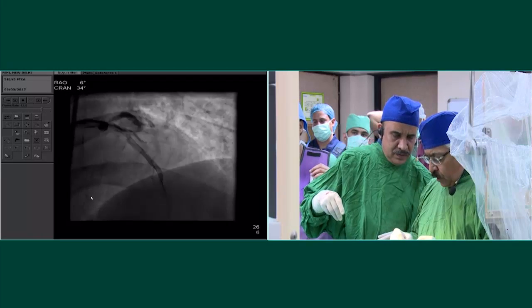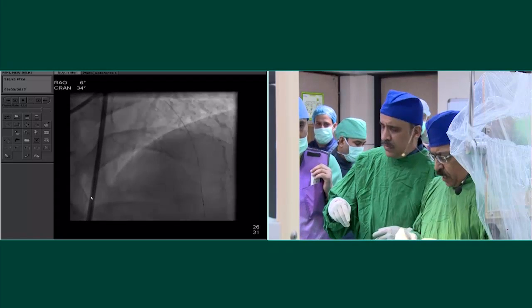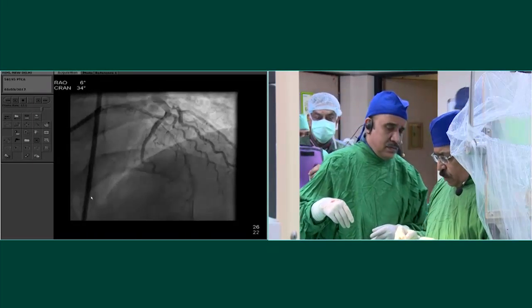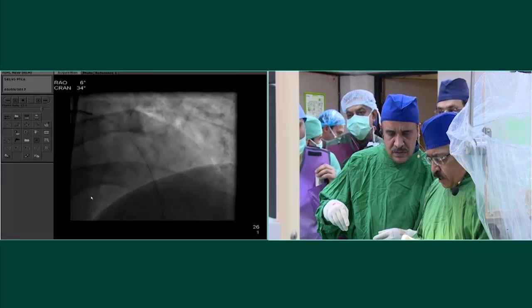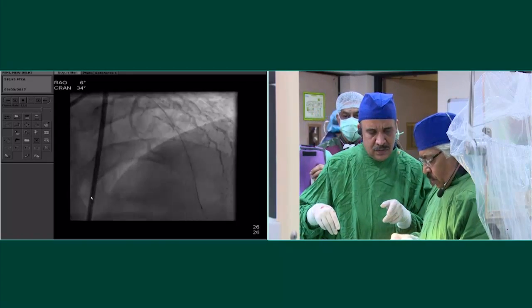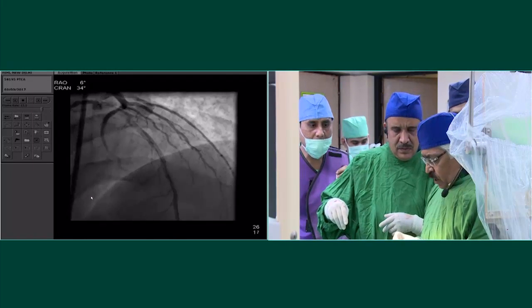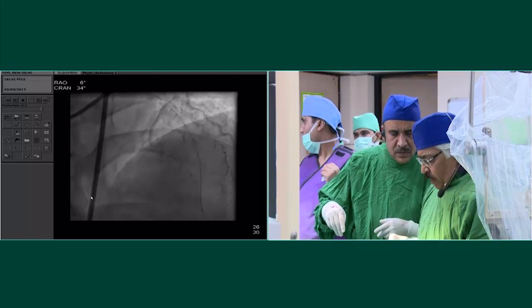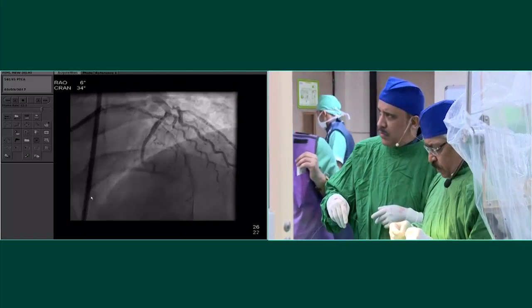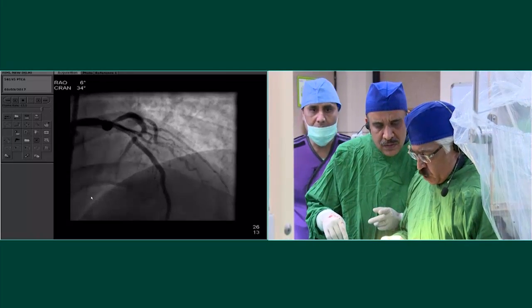Okay. You see, on the pre-dilatation, I must tell you my philosophy. I actually use a near optimal size balloon and get to the size, but I don't want to disrupt the vessel to such an extent that I have huge dissections where I'm trying to then cover the dissections. So as long as I've opened the lesion 80%, I'm happy. And I've propagated that philosophy very clearly: near optimal size rather than optimal size. I've had too many dissections which have required long scaffolds by going to 1:1 and high pressures.